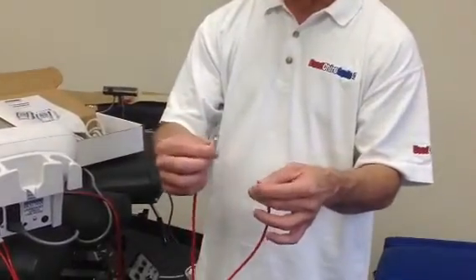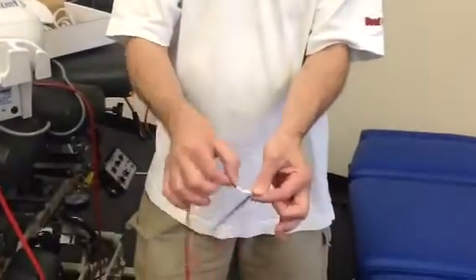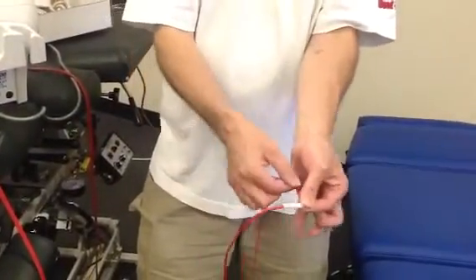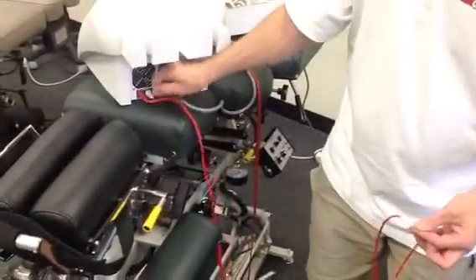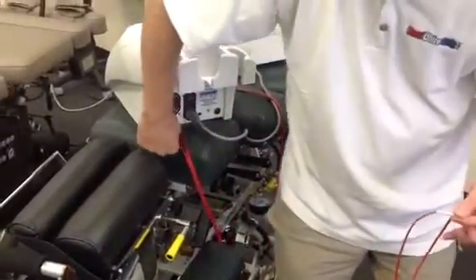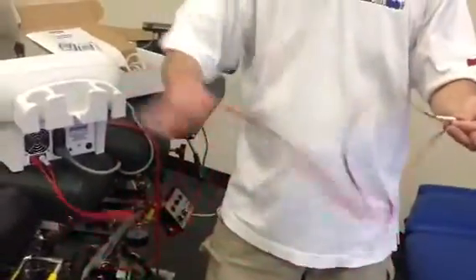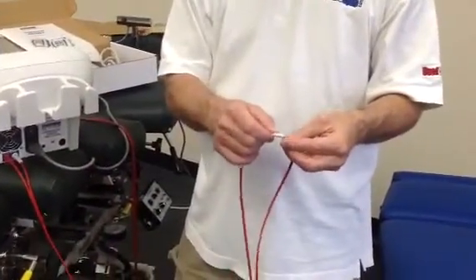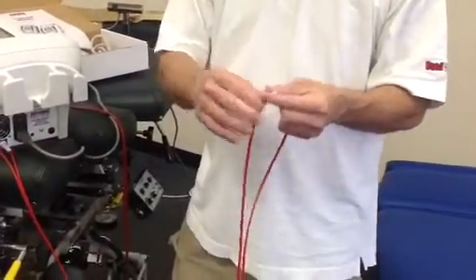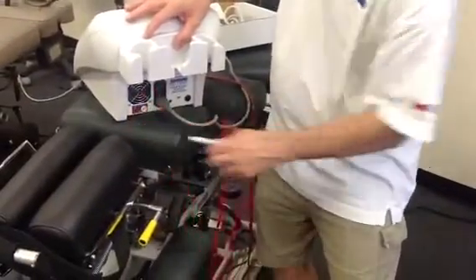But it's a multi-point test. You have to grab right here at the relief and wiggle. Grab right here at the relief and wiggle. Grab here and wiggle. Grab the other relief and wiggle. And then you grab it right in the center and shake it. At any point, if we have that sort of noise, you have a break somewhere and the lead cord is no longer any good. So there's your lead cord test.